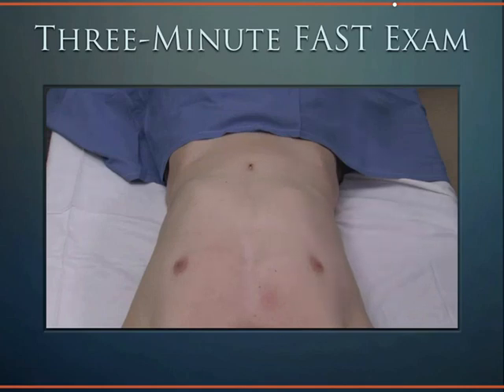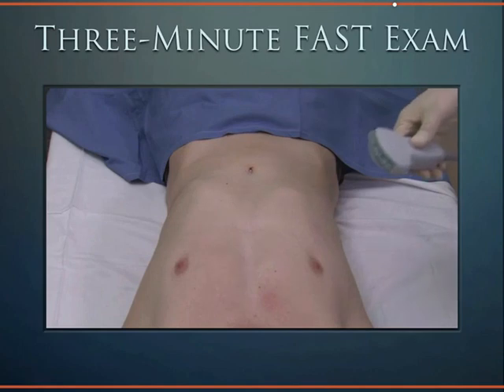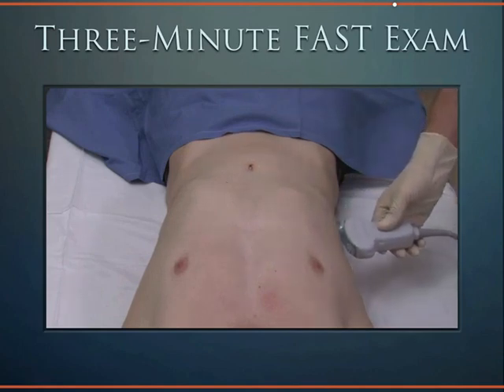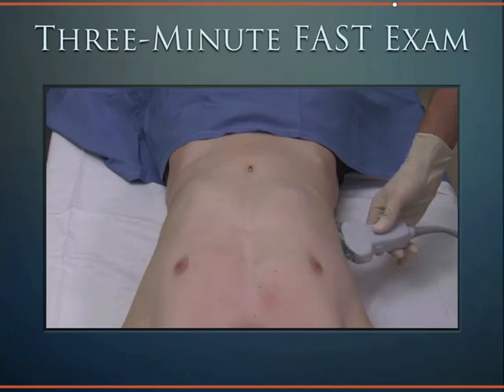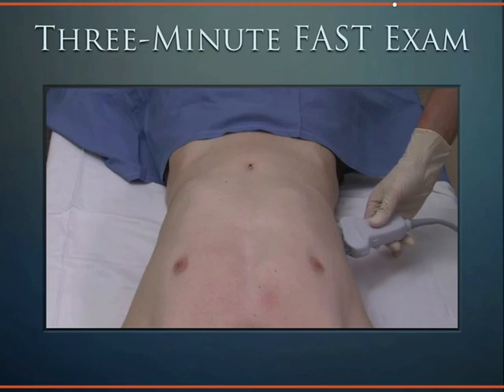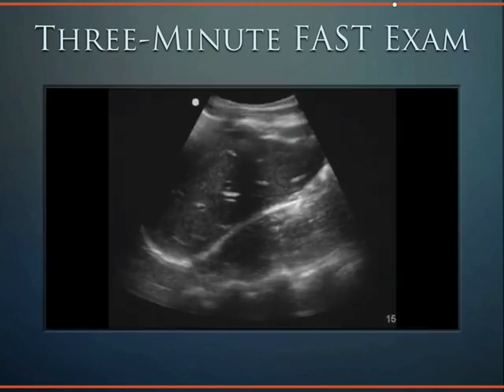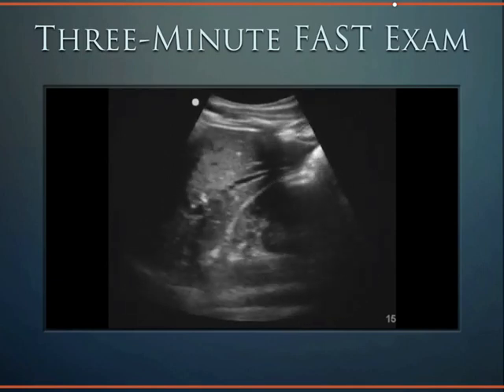The FAST exam has four major windows. The first window of the FAST exam is Morrison's pouch. With the indicator towards the patient's head, place the probe at about the tenth intercostal space, slide the probe superior and inferior, and fan the probe anterior and posterior in order to see all the way through the interface of the liver and the kidney.